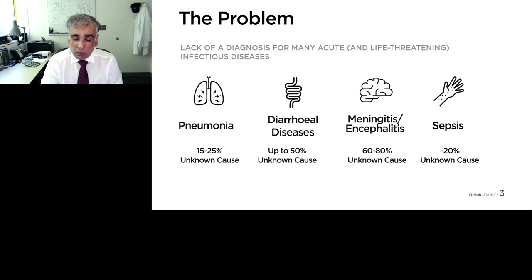I was certainly surprised to learn that, but many of you may already be aware that during peak flu season, for example, you have patients in the ER who are clearly in distress because of upper respiratory or respiratory involvement, and yet when you run them on these PCR panels, the assay still comes out as negative. And I'm sure all of you are already aware of the cases in sepsis and GI. So this is the problem.